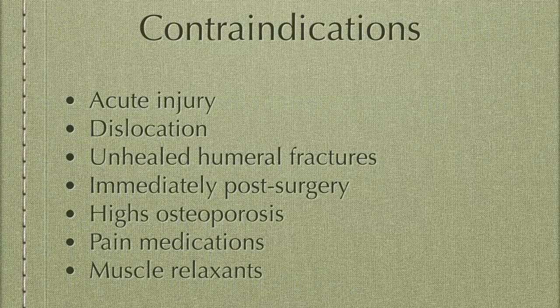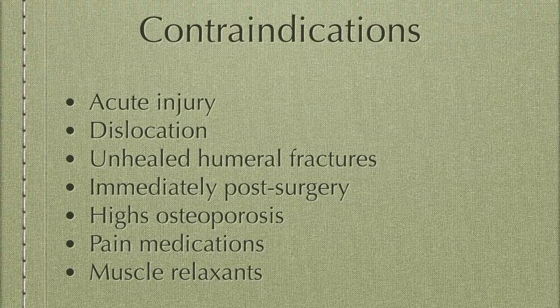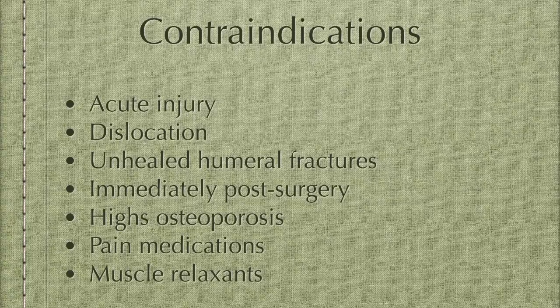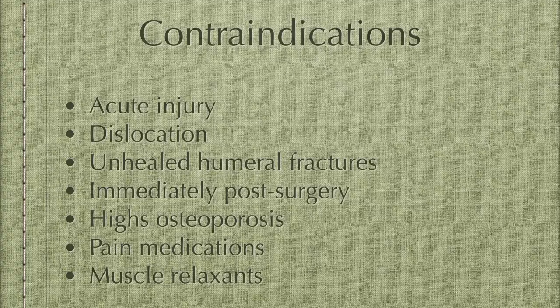Contraindications for the use of goniometric testing of shoulder flexion include acute injury, dislocation, unhealed humeral fractures, immediate post-surgery evaluation, areas of high osteoporosis, and in conjunction with pain medications or muscle relaxants.